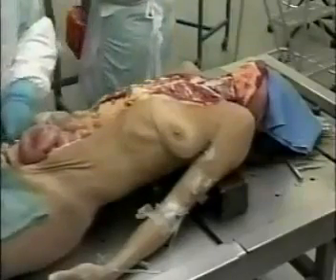Okay, what he's doing now is reflecting back, cutting where the diaphragm or the breathing muscle attaches to the side of the body and exposing the peritoneal cavity or the abdominal cavity.